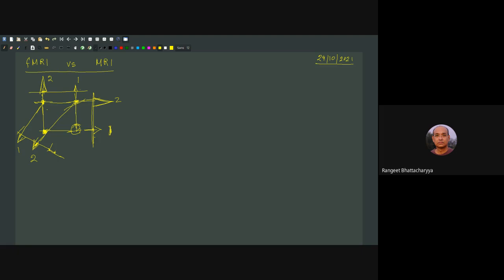So basically, after we got the pockets, if I draw it, it will look like just this. It looks simple. It's far from the actual brain images. But in the case of an actual brain, let us suppose it looks like this, a very bad drawing, but it will do. You can divide it into tiny regions. You can have a grid.